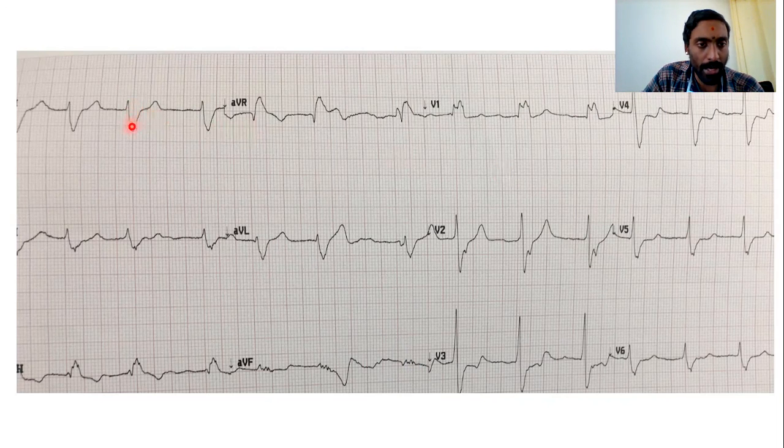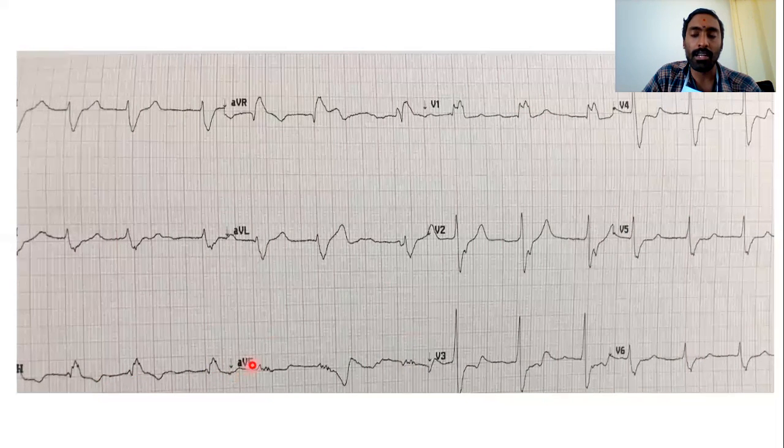Look here, there is a wide QRS. The QRS is wide, more than 120 milliseconds. Then the QRS here is also wide. Here the nomenclature would be RSR dash with a wide S wave in lead 1 and V6, which qualifies for a right bundle branch block with an irregular RR interval. So this patient has a right bundle branch block with atrial fibrillation in the background because of irregular RR intervals with absent P waves.